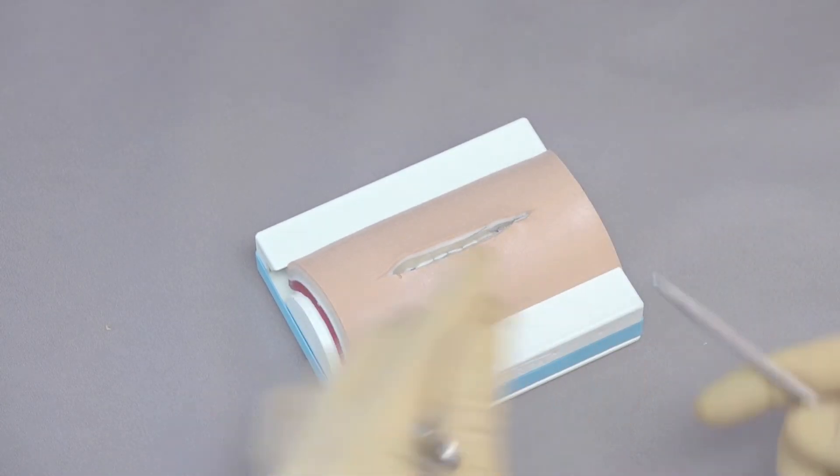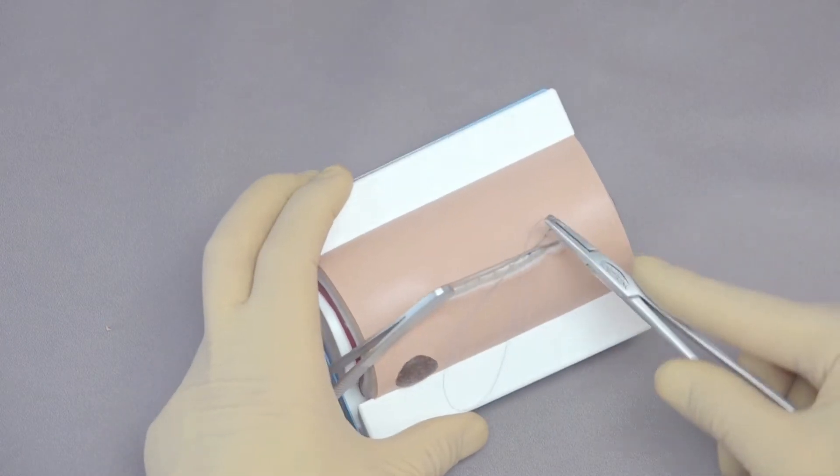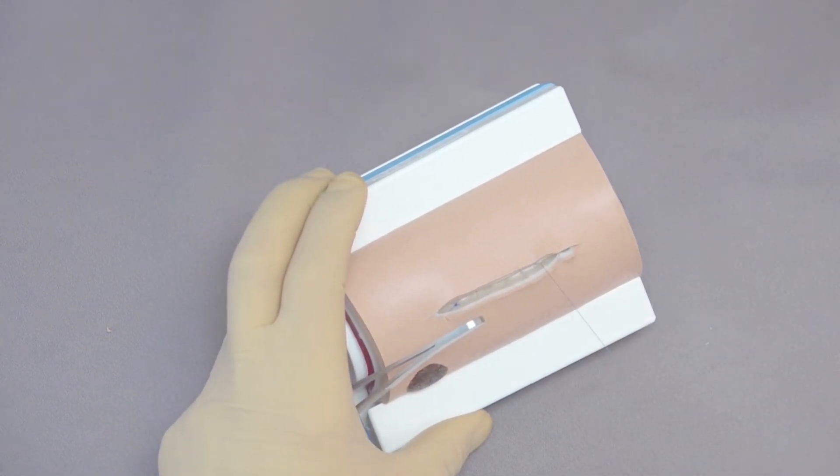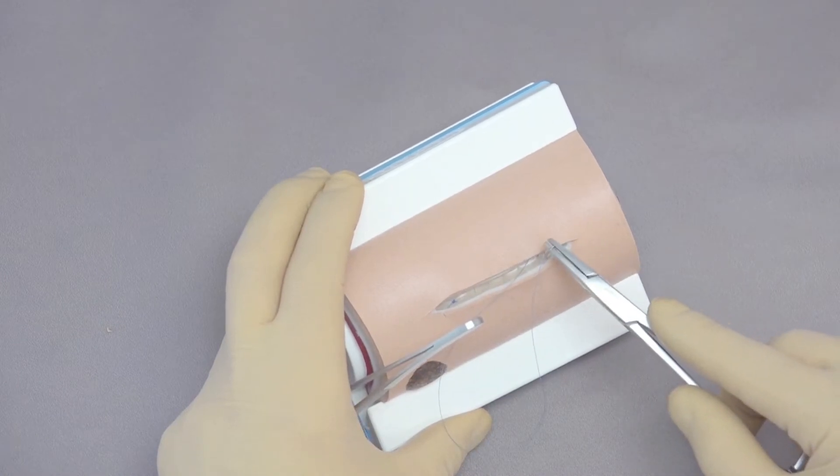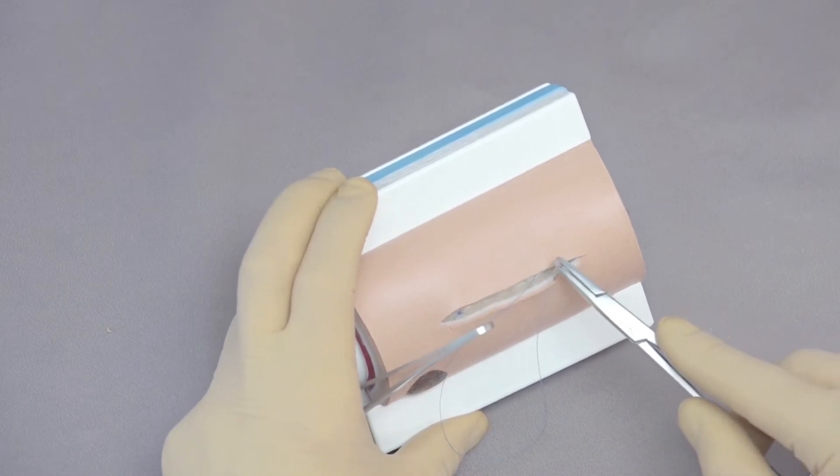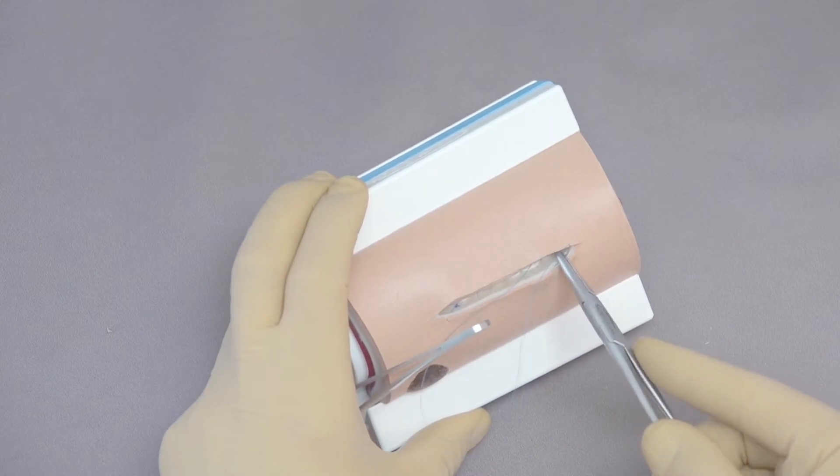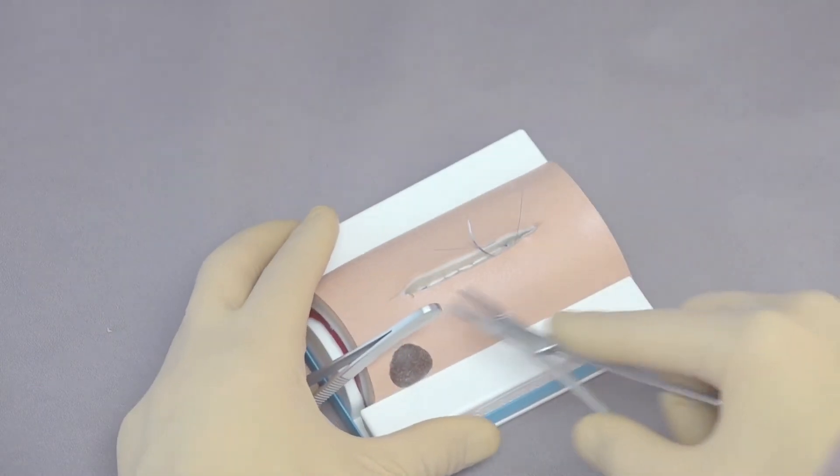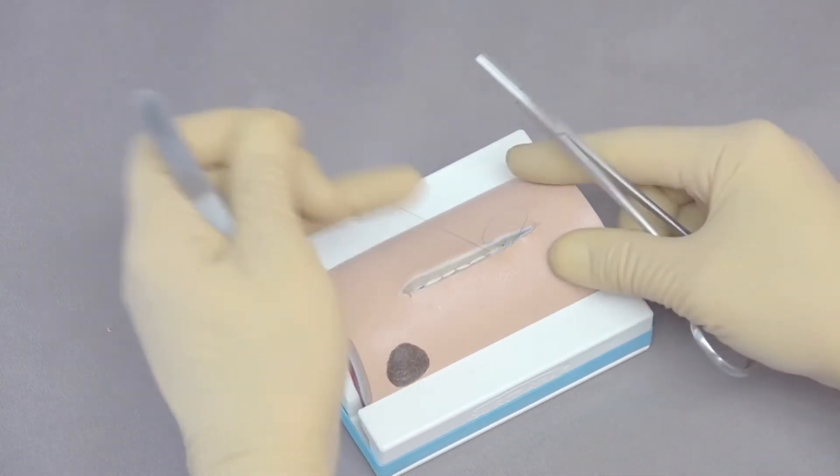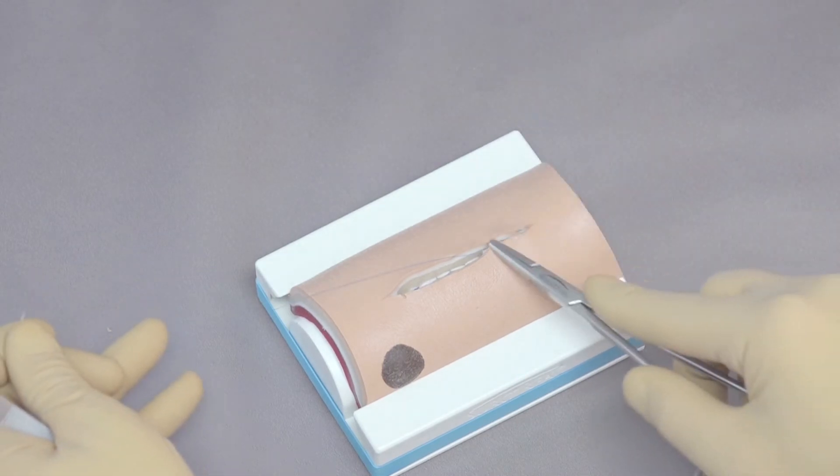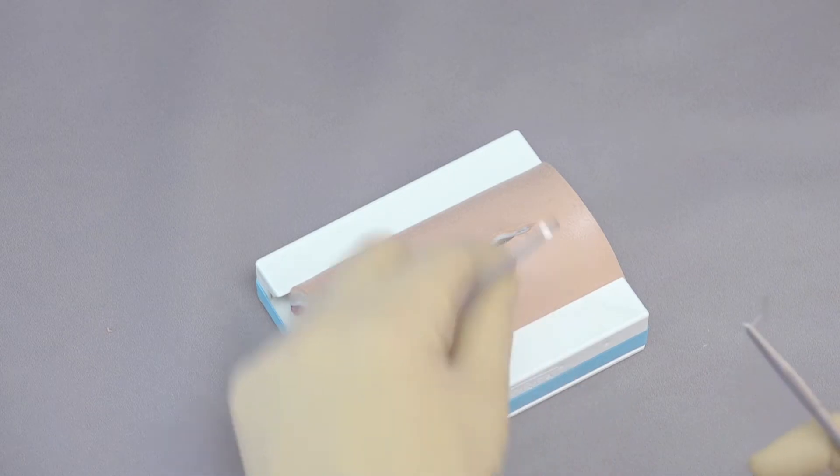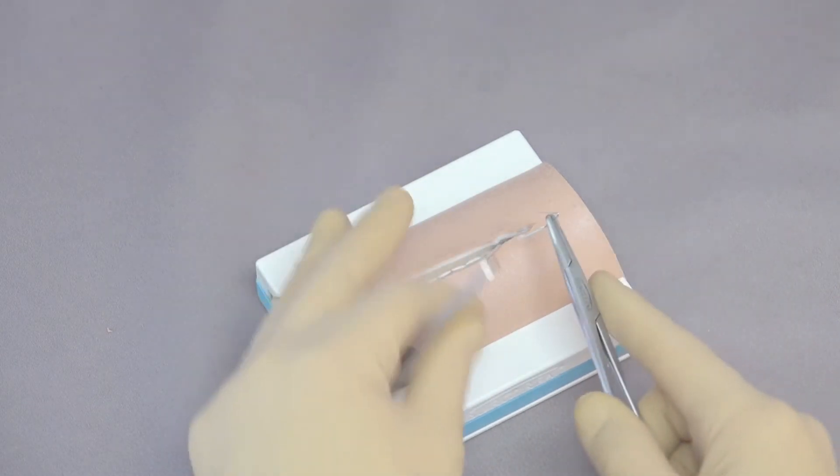And I want to continue through and to do this epidermal and dermal repair in order to accomplish this. So if you see here, I'm going to see right where the needle suture comes across. Make sure that my suture bite is right there between the dermis and the epidermis. If I take smaller bites along the edge like this, I will oppose the skin a little bit better. So it all matters on how you do that. You see, this bite was a little long, see how that's coming apart. So I need to be learning from that. And this tissue will help us to sort out how to do that.